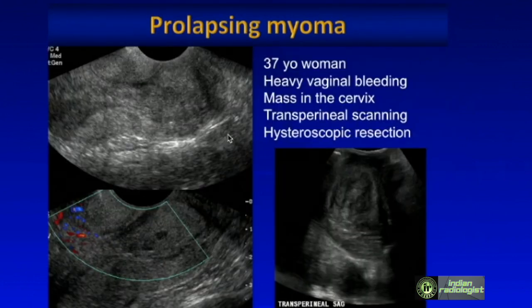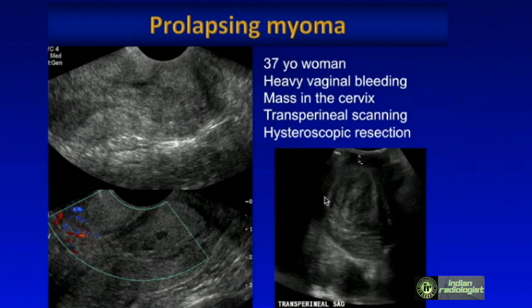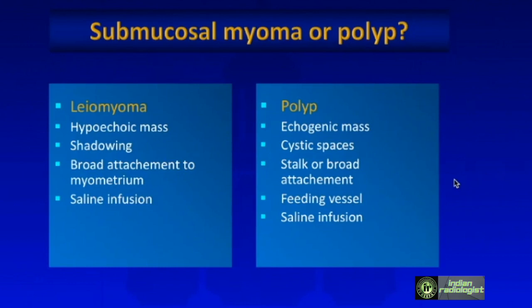This is a 37-year-old woman who presented to the emergency department with very heavy vaginal bleeding, and on examination there was a mass protruding in the cervix. With the vaginal probe, you can see the mass in the cervix and vessels leading to it. Transperineal scanning — placing the transducer on the patient's labia — was helpful here to show the myoma attempting to deliver itself through the vagina. This patient underwent emergency hysteroscopic resection due to marked anemia.